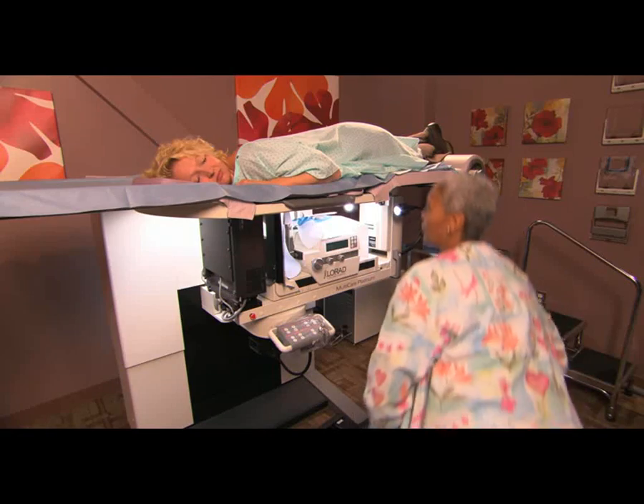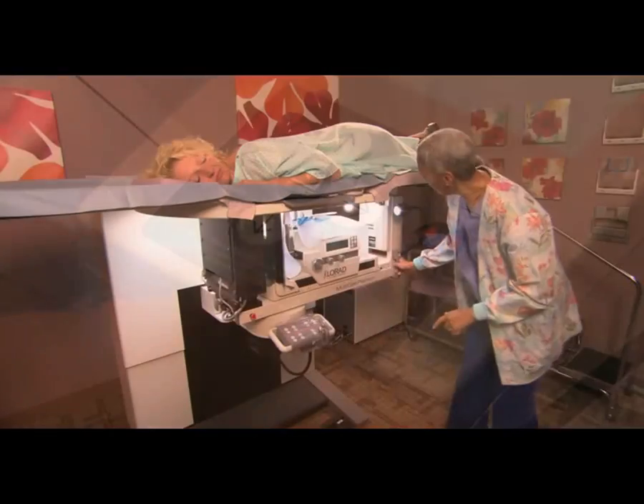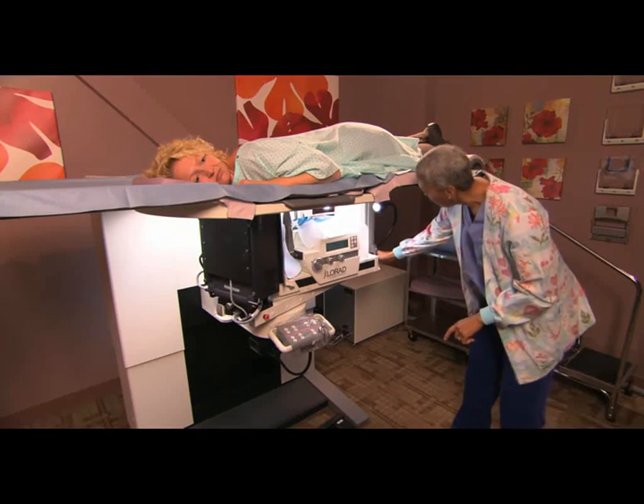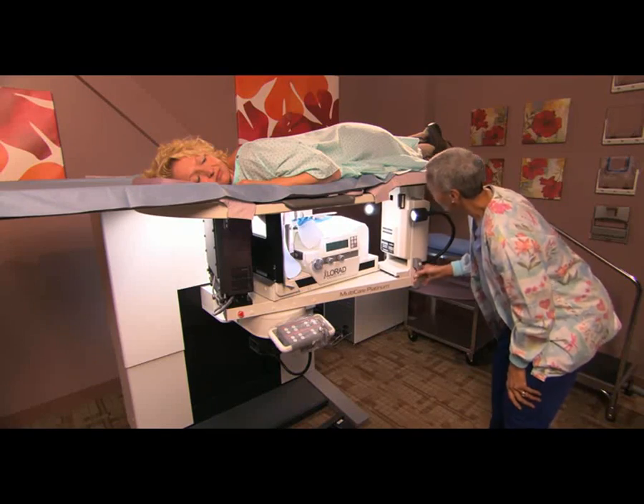Then three x-ray images — center, left and right — are taken. These stereo pictures will pinpoint the exact location to take the tissue sample.